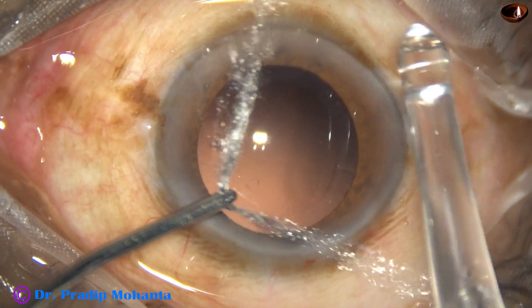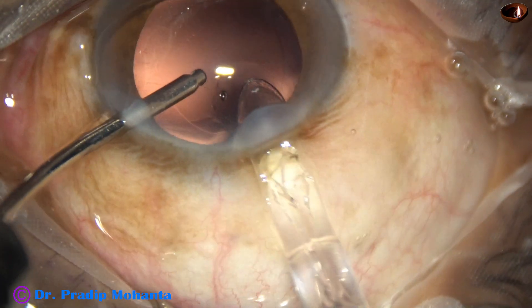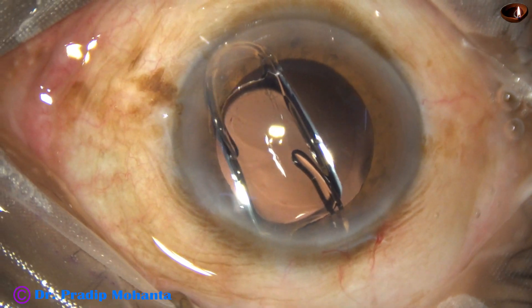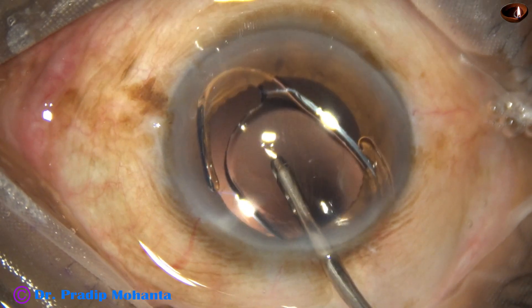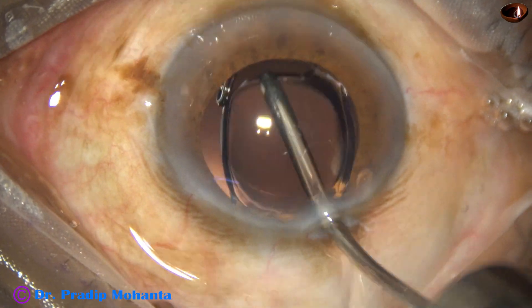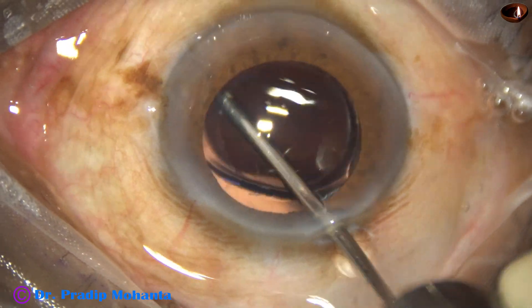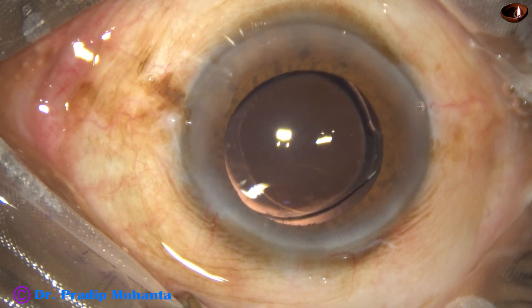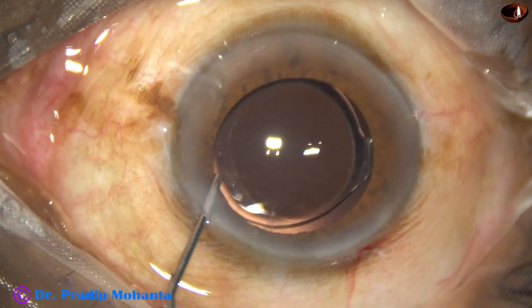Now the lens goes. In this case, I could not place the lens in the bag initially — it ended up in the anterior chamber. I used the irrigating probe itself to place the lens in the capsular bag. The trailing haptic went into the bag first, followed by the leading haptic.